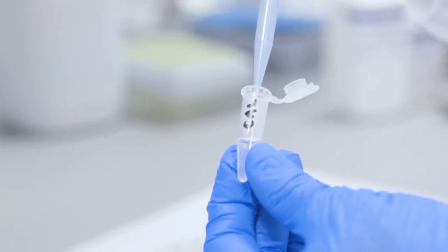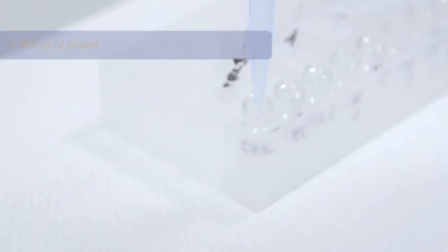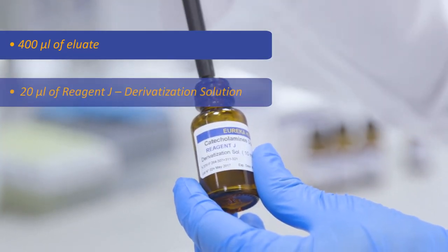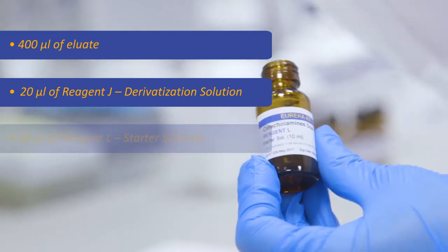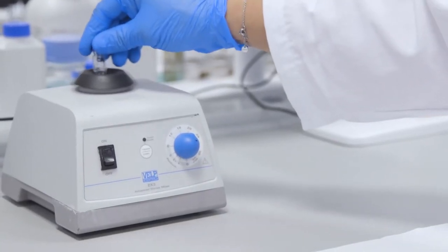The next phase involves the derivatization of catecholamines. Pipette sequentially into 1.5 milliliter reduced volume glass vial with stopper: 400 microliters of eluate, 20 microliters of reagent J derivatization solution, 20 microliters of reagent L starter solution. Activate the vortex for five seconds.